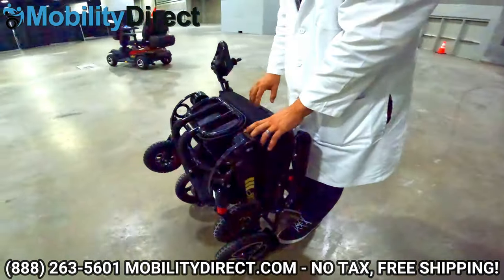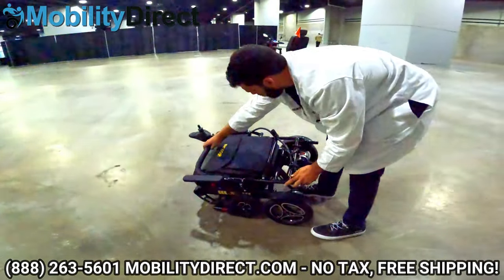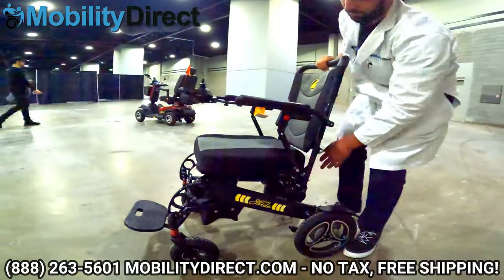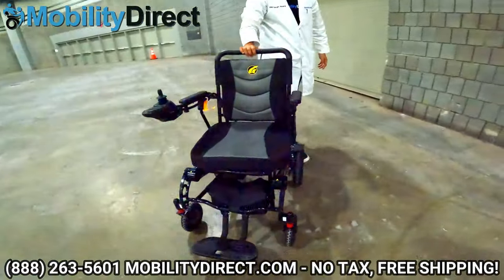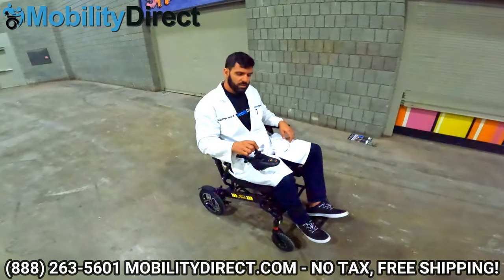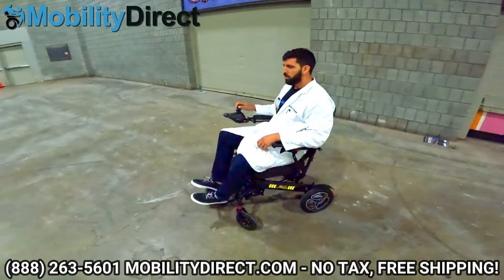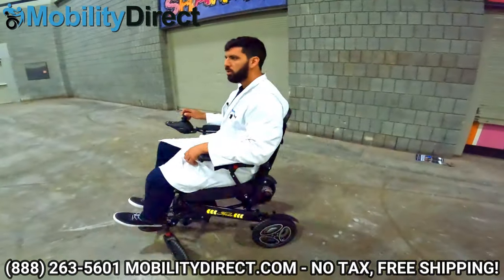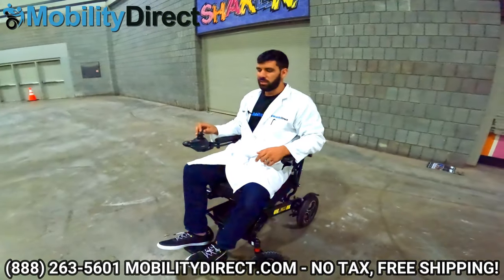When you're ready to unfold it, just tilt it back down and lift up on the backrest. Make sure you secure that latch when you're done and it's ready to go. It has a great turning radius — if you're indoors in a small area with a lot of furniture and don't have a lot of room to turn around, this is a great power wheelchair to consider.